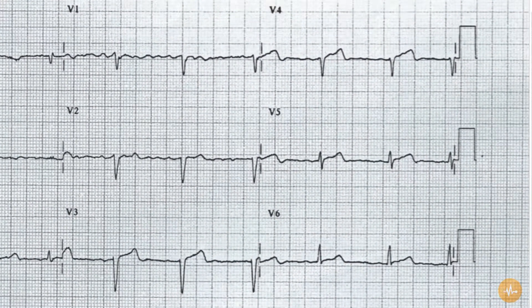The chest lead morphology of the QRS complex is abnormal, however, with late dominance of the R wave. The R wave only becomes greater than the S wave at V6. R wave dominance is usually seen in either V3 or V4.